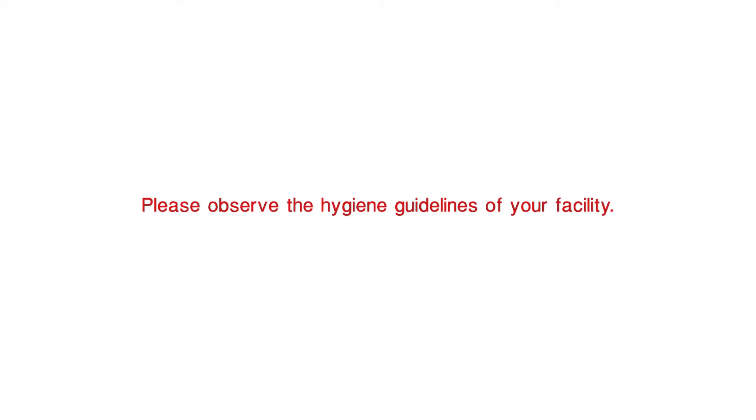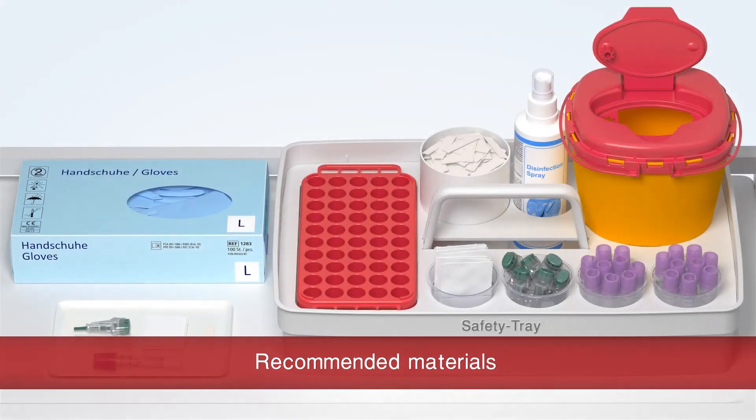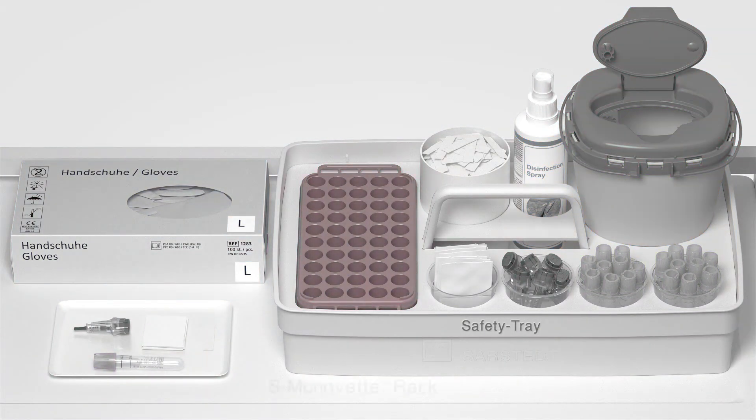Please observe the hygiene regulations of your facility. You will need the following items: S-Monovet Rack, Swab, Safety Lancet, MicroVet APT500 Multi-Safe Disposal Box, Disinfectant Spray, Plaster, and Gloves.